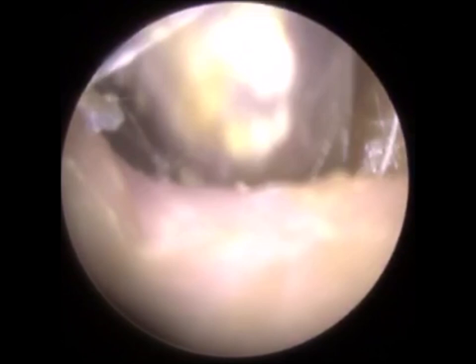Another huge piece. And all this was hidden away. It was all hidden away in that trench, that cave, in the mastoid cavity. If you remember what I said earlier, you'd be quite surprised, because when I removed all the debris and keratin from the original part of the ear canal, when you were visualising what was left, the remnants, it didn't appear like a lot. But I did mention at that time, you'd be surprised later on in the video how much there was.